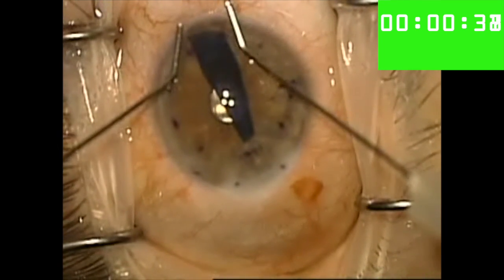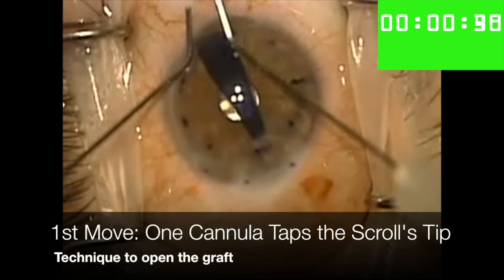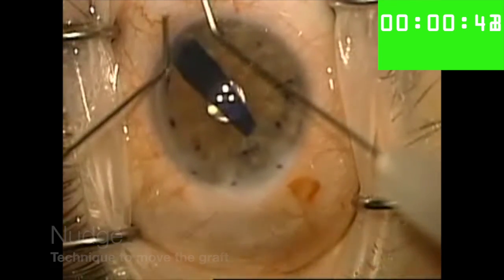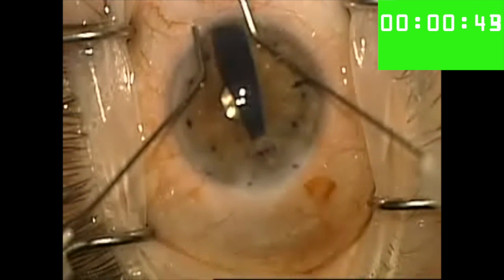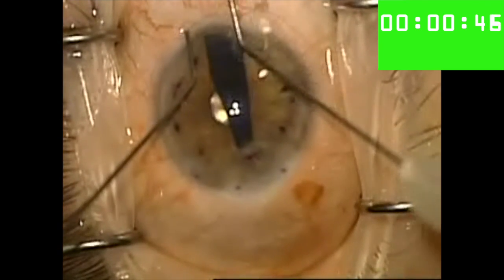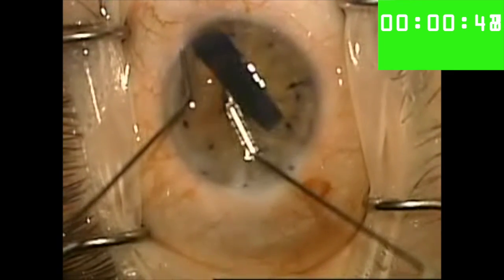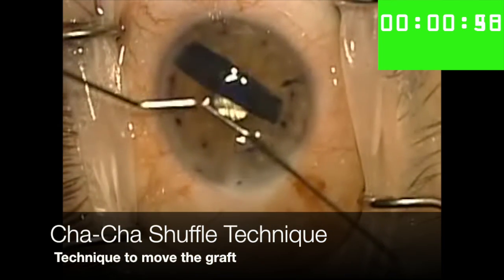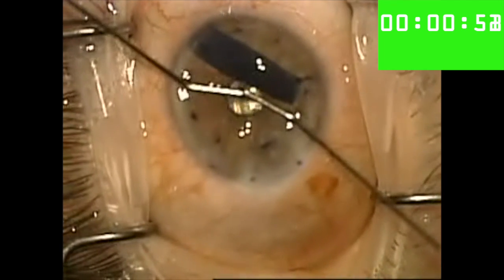In another attempt, again my opening move is to use one cannula to tap one end of the scroll, and you can see that the scroll is beginning to respond but not quite as much as I would like. I nudge it back to the right again and I try tapping some more. At this point I decide to reposition the scroll in the shallow part of the anterior chamber again, this time using a cha-cha shuffling technique, which is basically a hand over hand nudging maneuver.